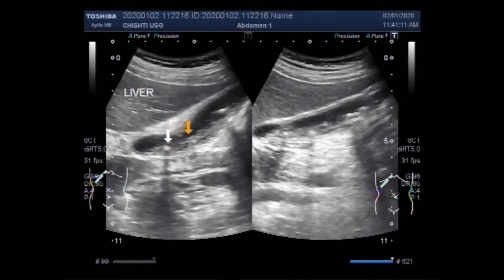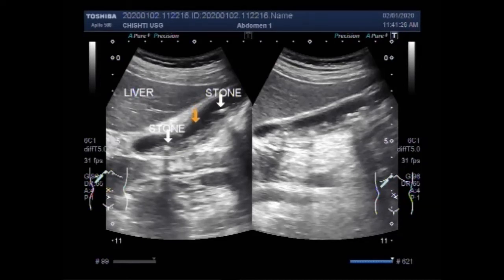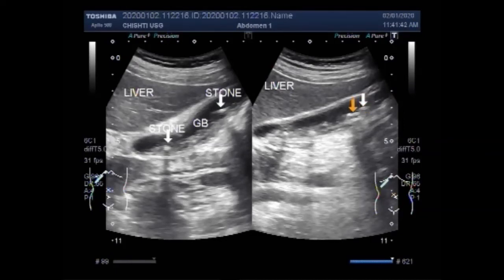This is a stone and this one is also a stone. This is the liver and the gallbladder. These are the small stones along with a significant amount of thick sludge. You can see the stone shadowing.